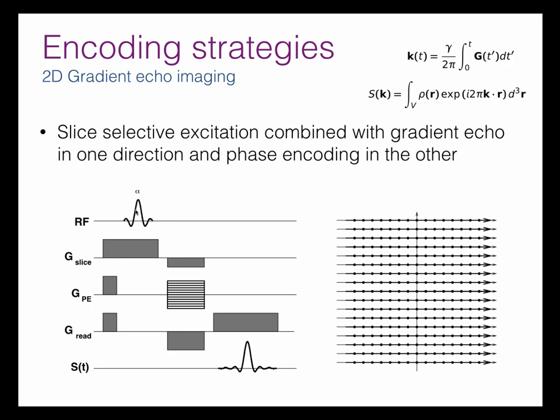If, on the other hand, you have a long TR and a long TE, then you'll have a lot of T2 star decay, so you'll be much more sensitive to the different susceptibility areas which the magnetization's in. Okay, and there's a similar argument for spin echoes too: if you have a long TE in a spin echo sequence, you'll be more sensitive to T2 because you'll have refocused the T2 star effect and you'll basically be on that T2 curve again.